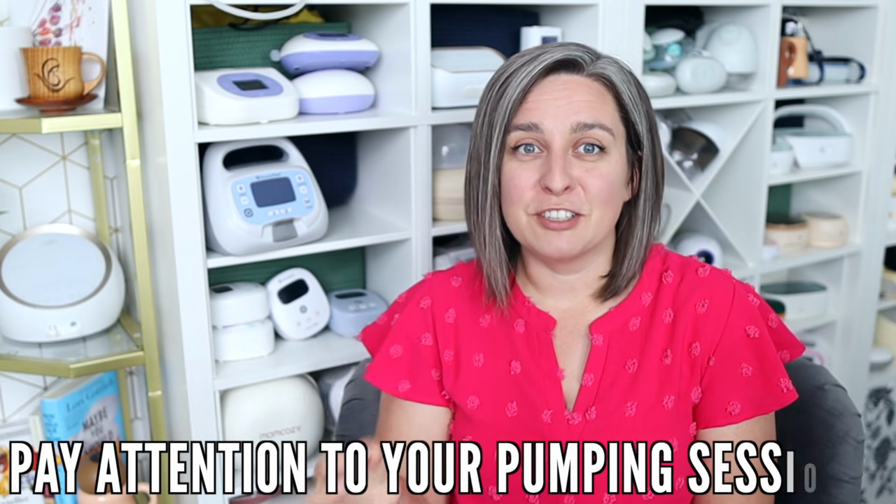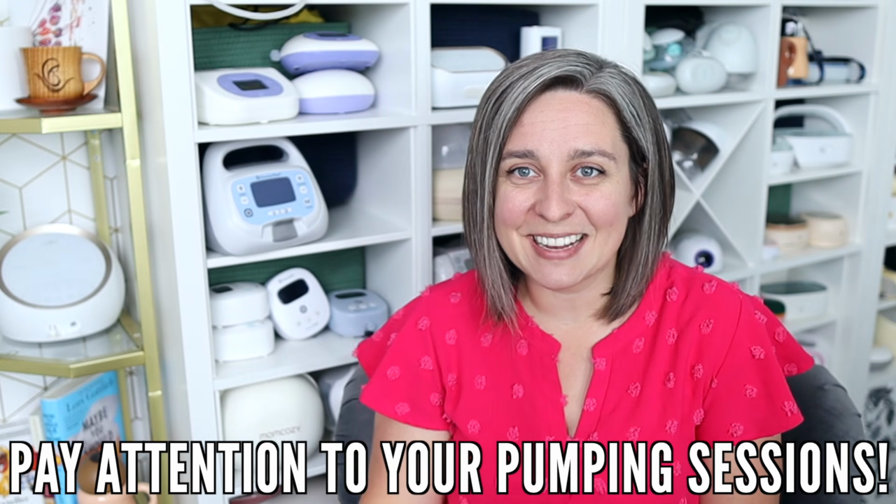And please, please, please pay attention to your pumping sessions. Multitasking during pumping seems amazing, but often it causes a lot of problems. You'll still need to trigger multiple letdowns, and since you can't see them anymore, you're going to need to be aware of how and when to do this, all right? So you might need to adjust settings during the session like we would on a more traditional pump, all right? So make sure you're still doing the things that you would do in other pumping sessions.